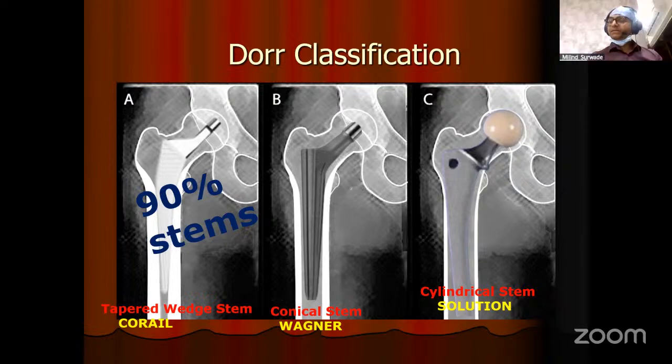One more: can you give some tips on improving the press fit of the cup in an RA patient, or an ankylosing patient who has very osteoporotic bones? Are there any tips on which cup we should use and how? What is your technique to get a perfect fit?